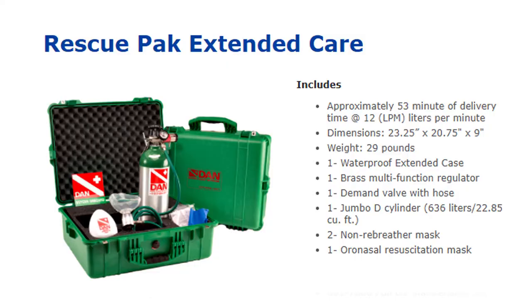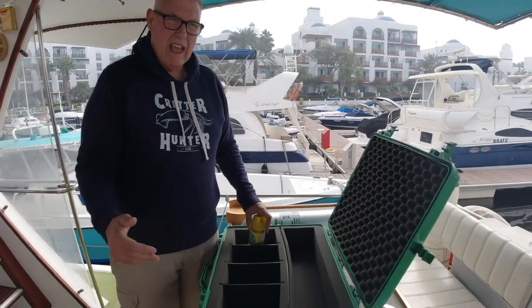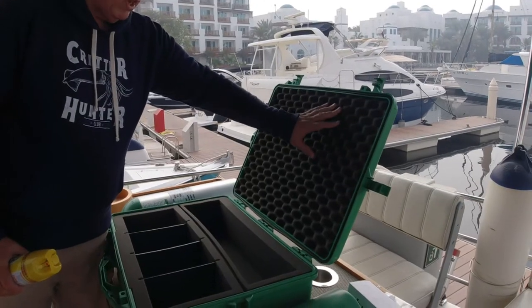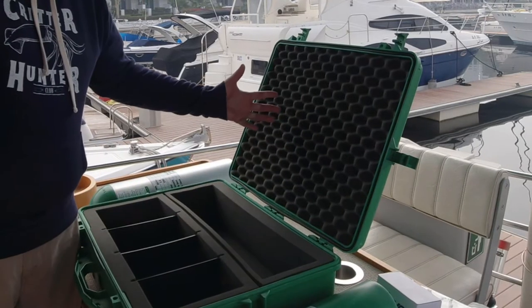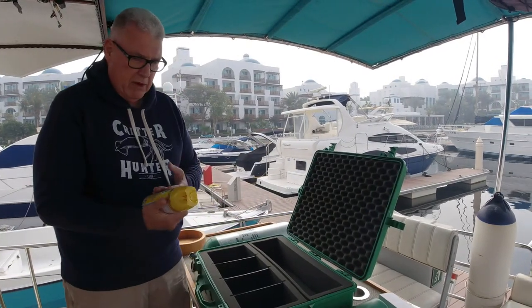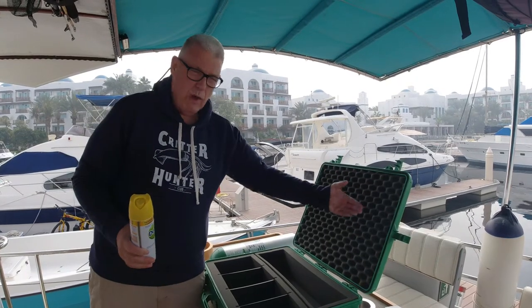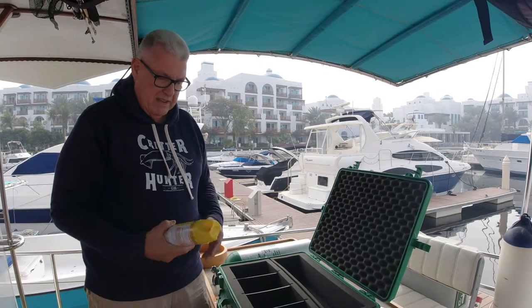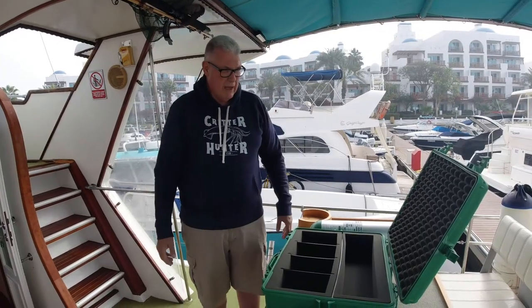The kit we've got is the DAN Rescue Pack Extended Care — the 1994 version. You can see here all the components. I've added some extra items, but we'll start with the box. This foam was in good condition but a bit smelly; it hadn't been dried out so we washed it fully with detergent. It took a couple of days to dry out and then we sanitized it — just spray it and leave it. Every time you check the box, take everything out and let the box air. If it's wet, wash with detergent, let the foam dry in the sun or a warm room, then give it a spray with Lysol or Dettol.